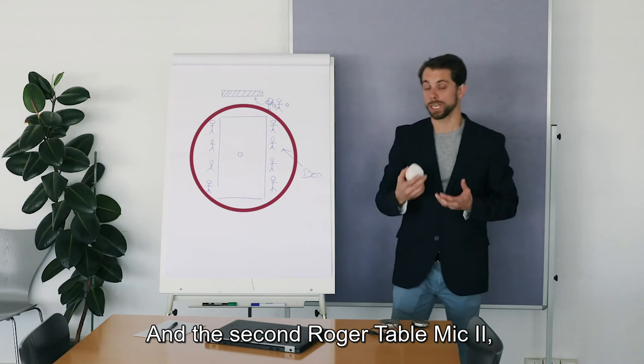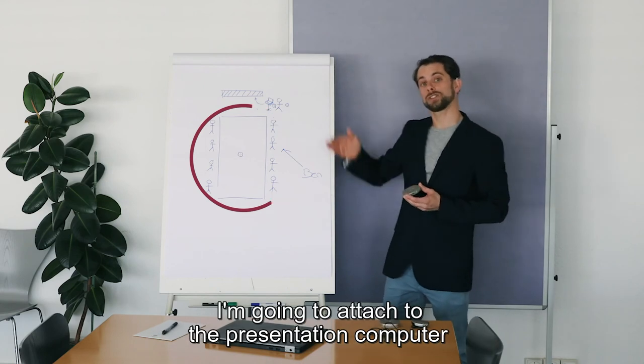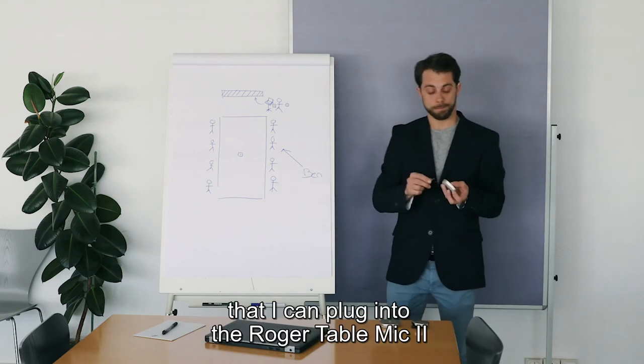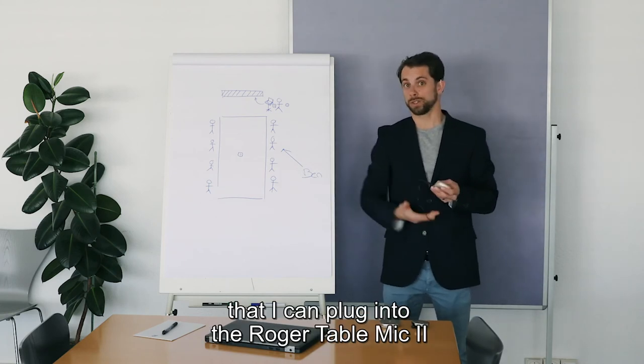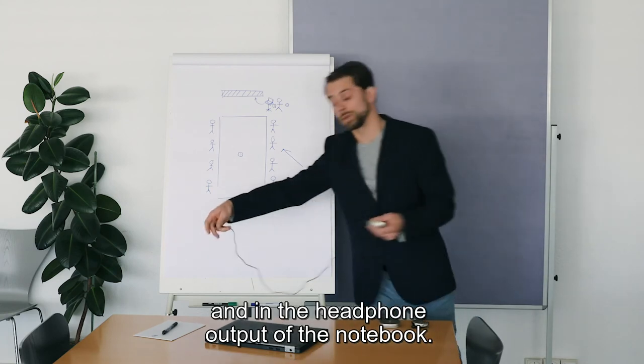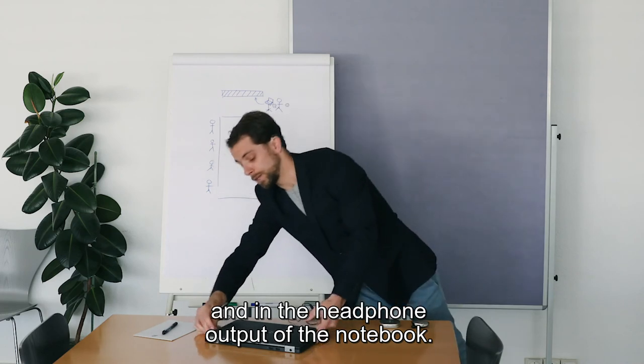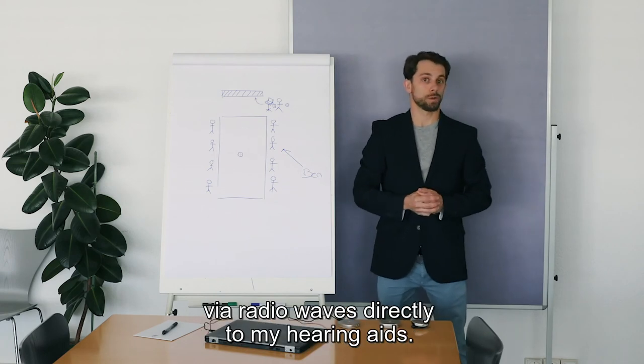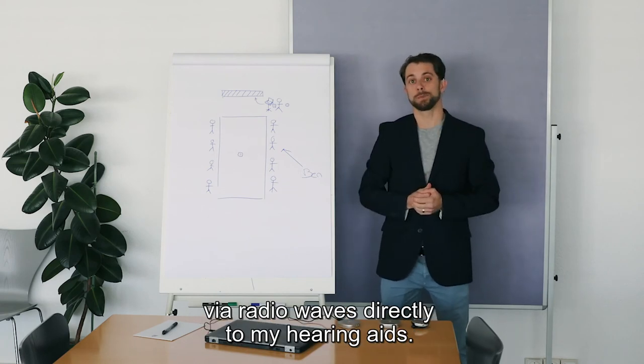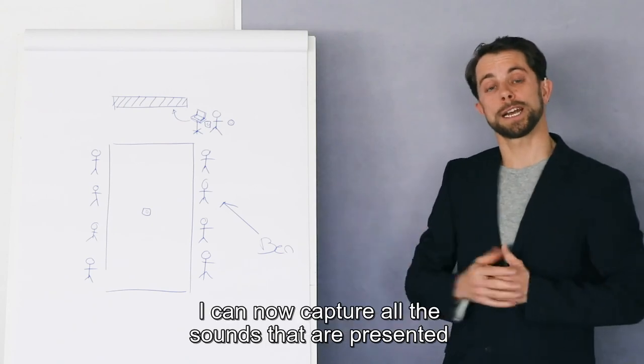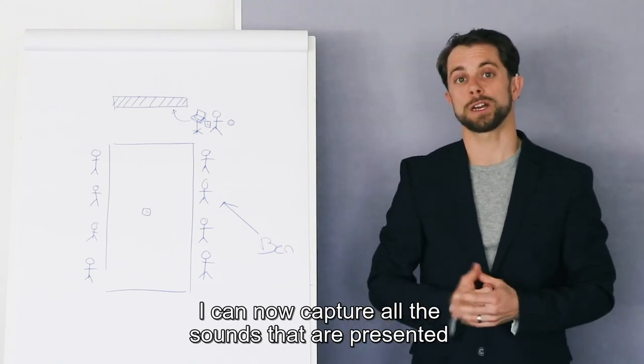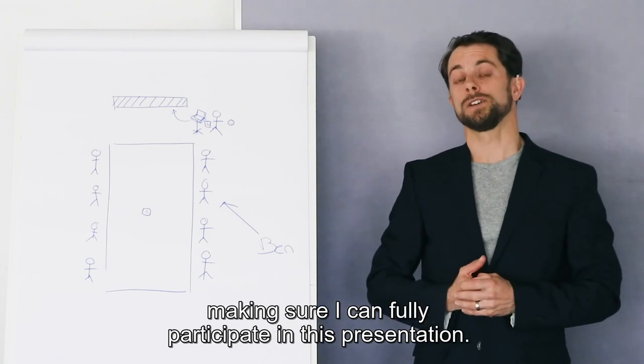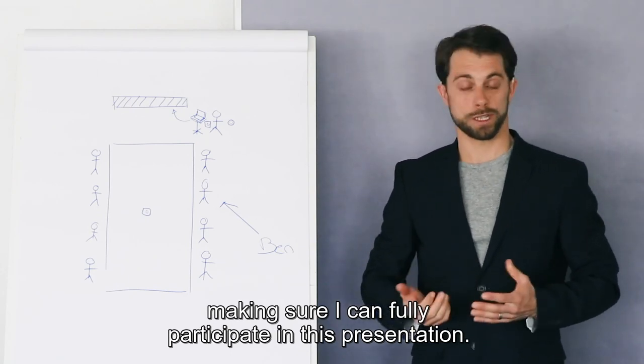And the second Roger Table Mic 2, I'm going to attach to the presentation computer with a simple audio cable. I can plug into the Roger Table Mic 2 and the headphone output of the notebook. Now, the sounds from the videos are also transmitted via radio waves directly to my hearing aids. With this configuration, I can capture all the sounds presented during this presentation, making sure I can fully participate.